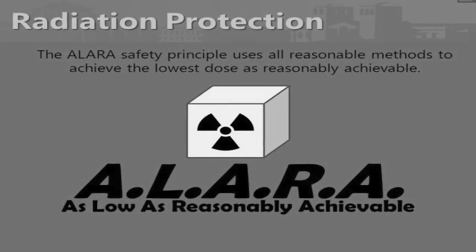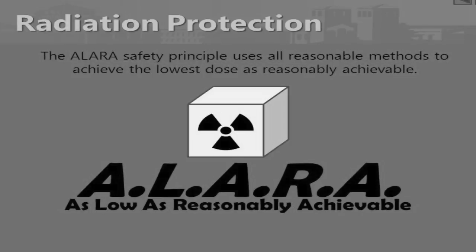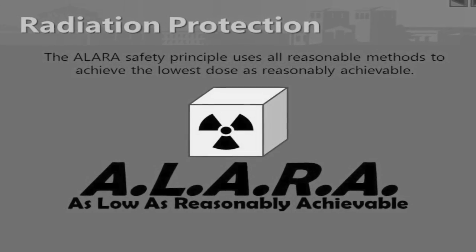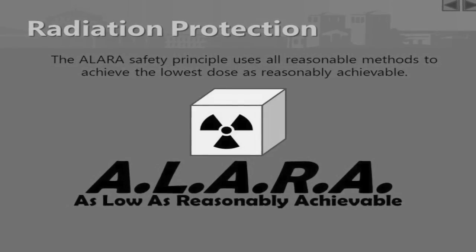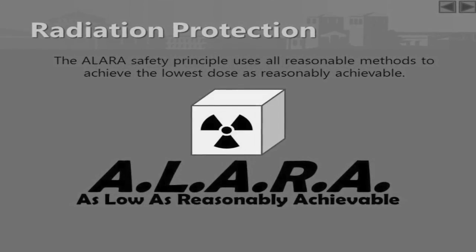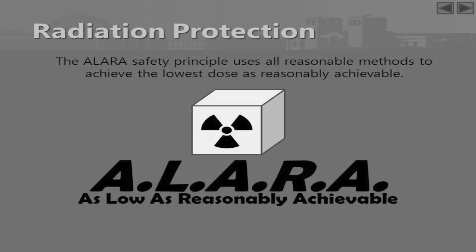Underexposure results in increased quantum mottle, reduces image quality, and may impede diagnosis. Overexposure reduces quantum mottle, improving image quality, but will also increase the patient's dose.